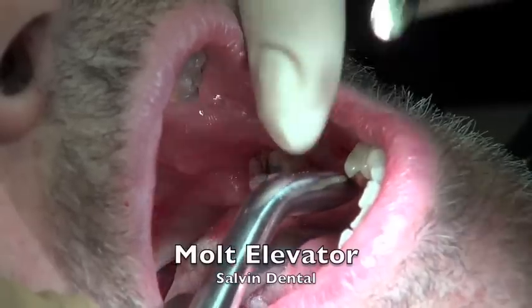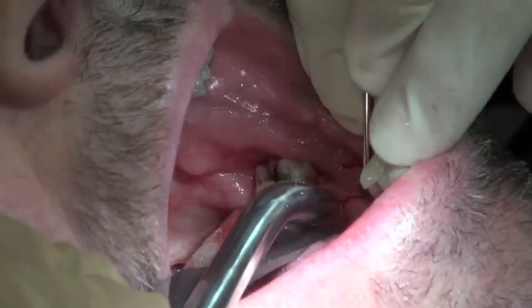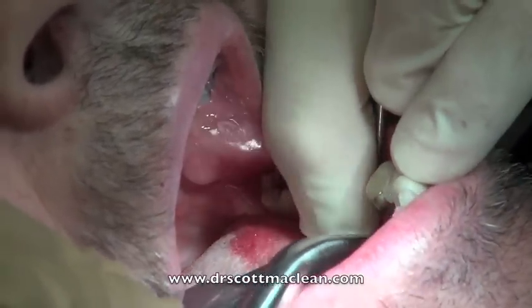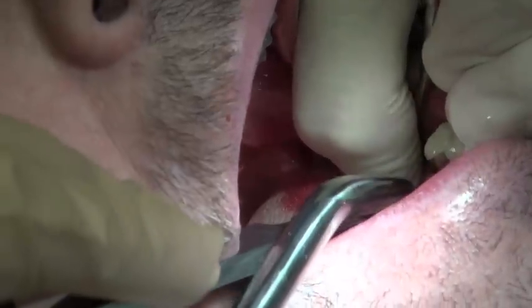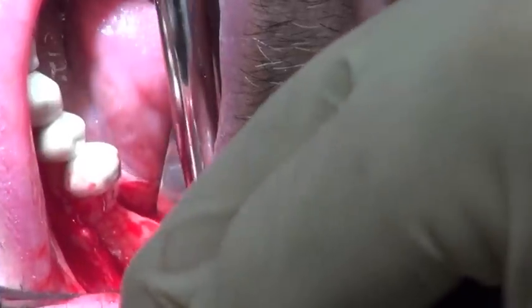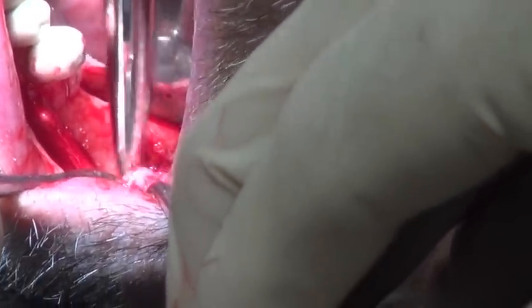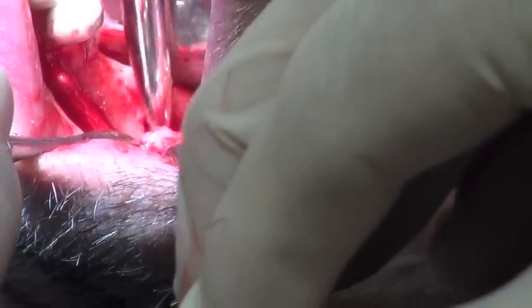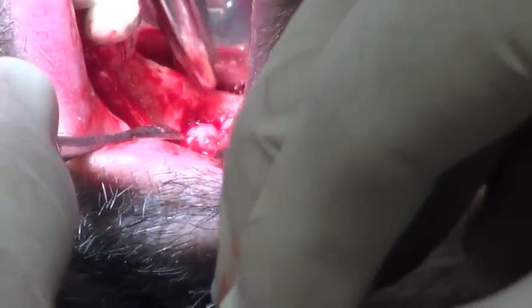You need to be through that periosteum to make sure that this is going to flap properly. So you take the molt elevator in this case, put some pressure behind it pushing down to the ridge, and the flap will actually elevate quite easily. This allows you to see the ridge for defects. In this particular case we have a defect we're going to scoop out, clean, and bone graft, but the anterior site is quite nice, so we're going to be placing an implant there.